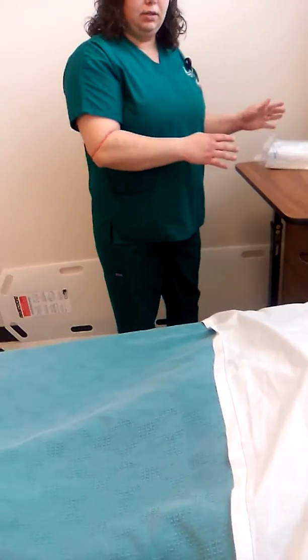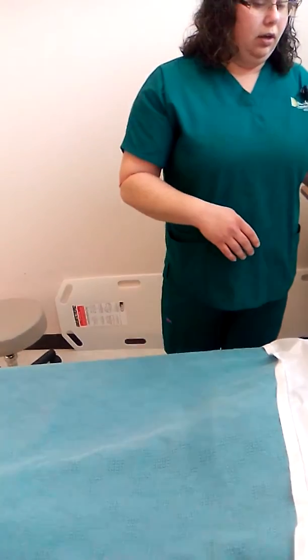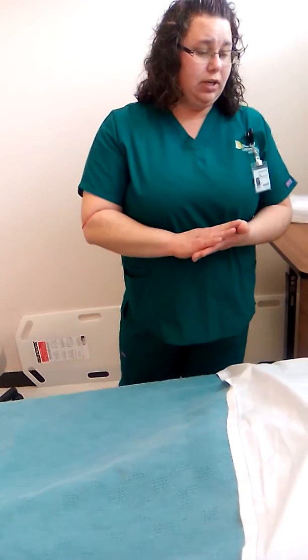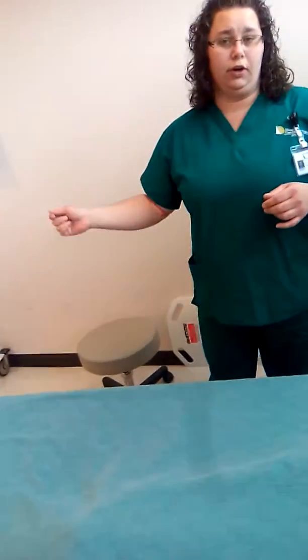I will bring it back to the bedside. I will re-perform hand hygiene. I will explain the procedure to the patient, and I will provide privacy by closing the curtain and the door. I will have arranged for assistants to help me with the catheterization, and I will ensure that the bed is at a proper height, head of the bed is down, and I will position and drape the patient.